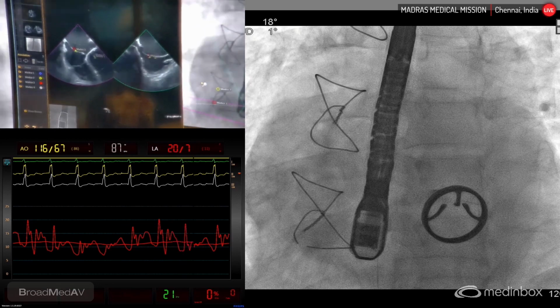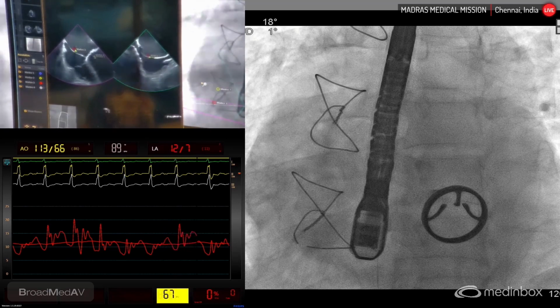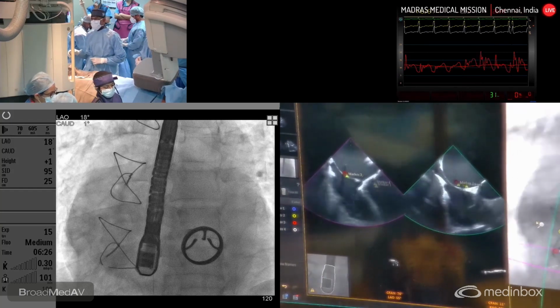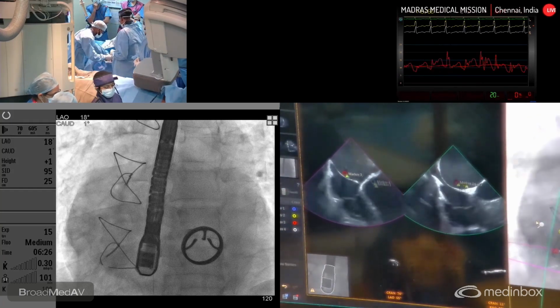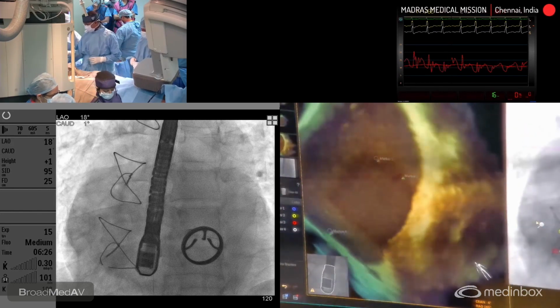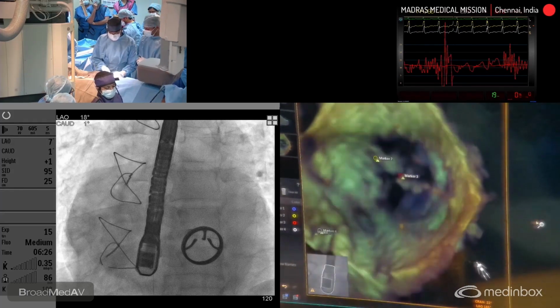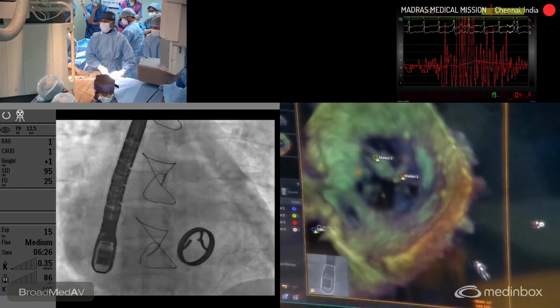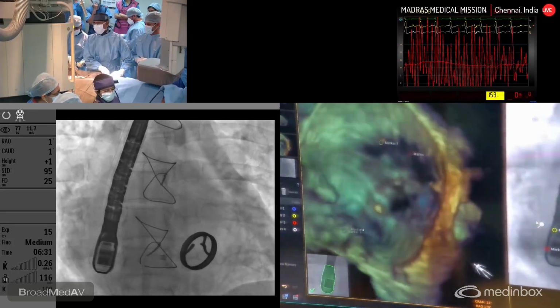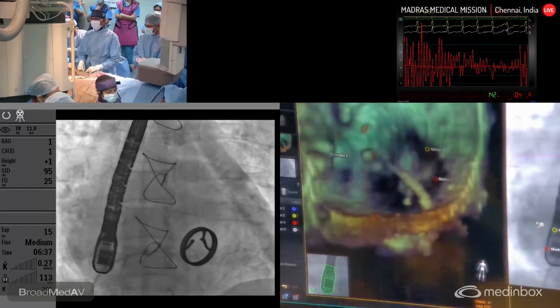So at this point, let me get the right coronary catheter. A right coronary catheter, leave it to him. Right coronary catheter. So we are planning to enter into one of the pulmonary veins and change it into a Fustar sheath. A Fustar sheath is basically a deflectable sheath. It's something similar to the Abbott's Agilis sheath. Abbott's Agilis is a 8.5 French sheath, whereas a Fustar is available in multiple sizes. So we may be using, this is the left atrial entry.